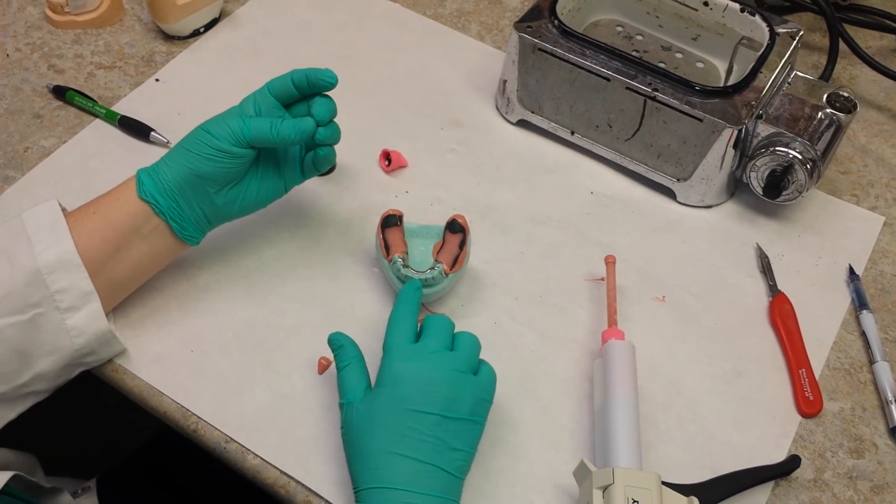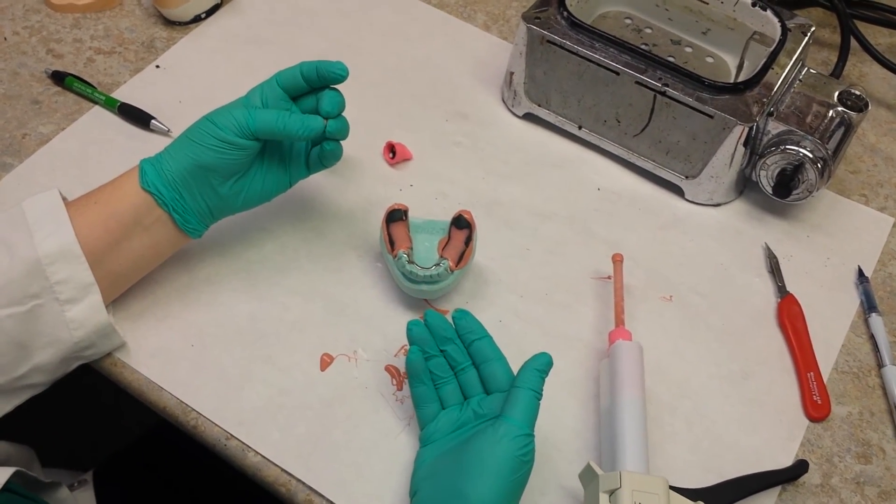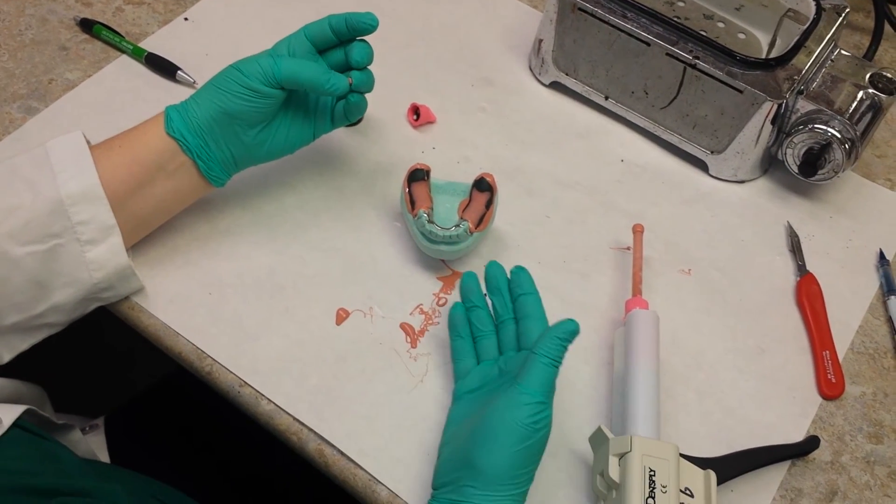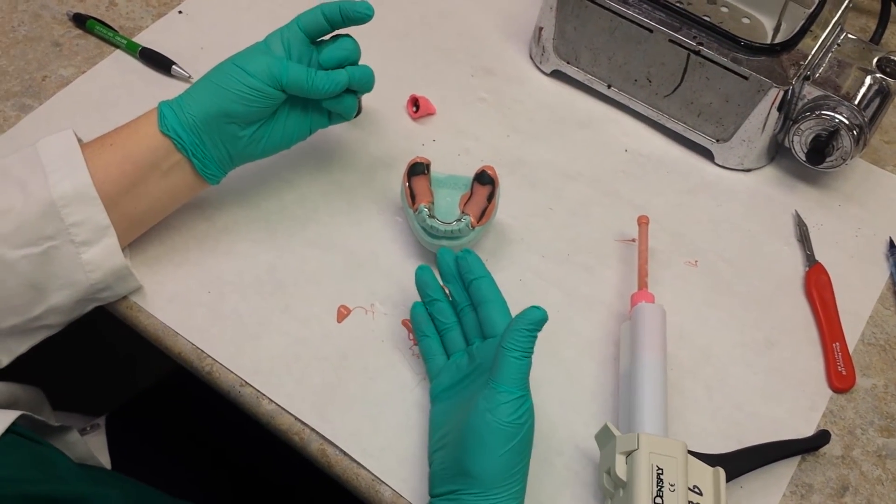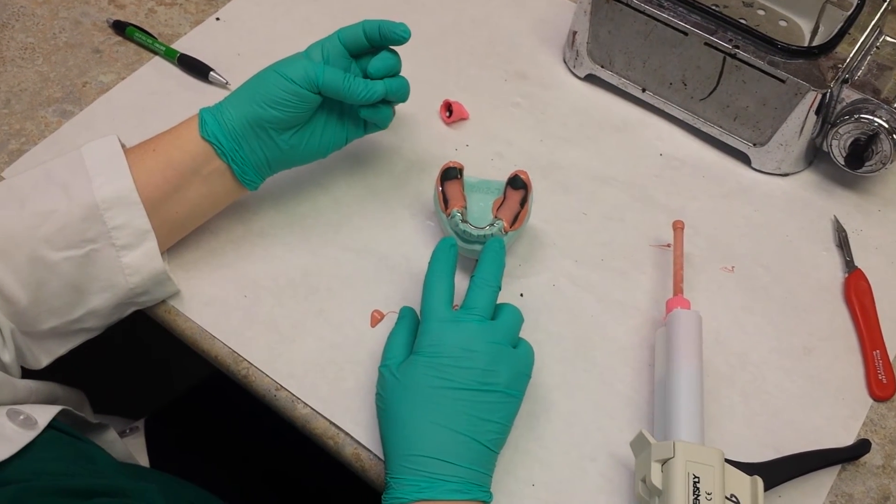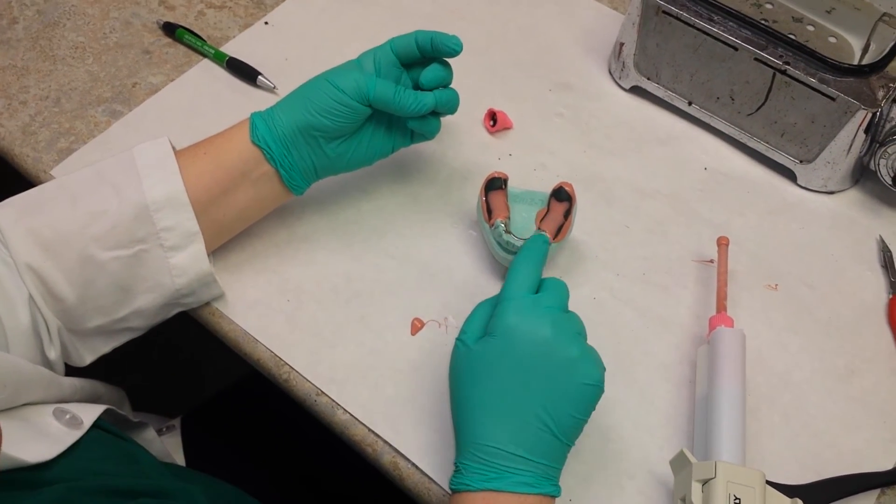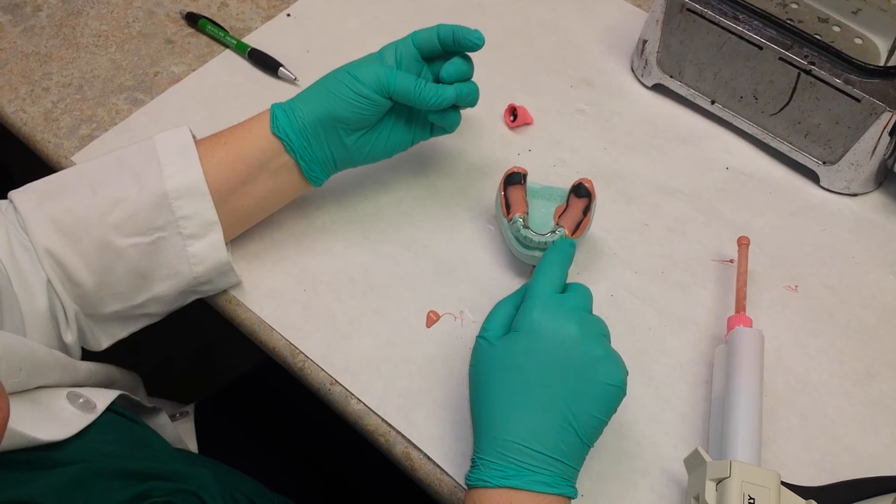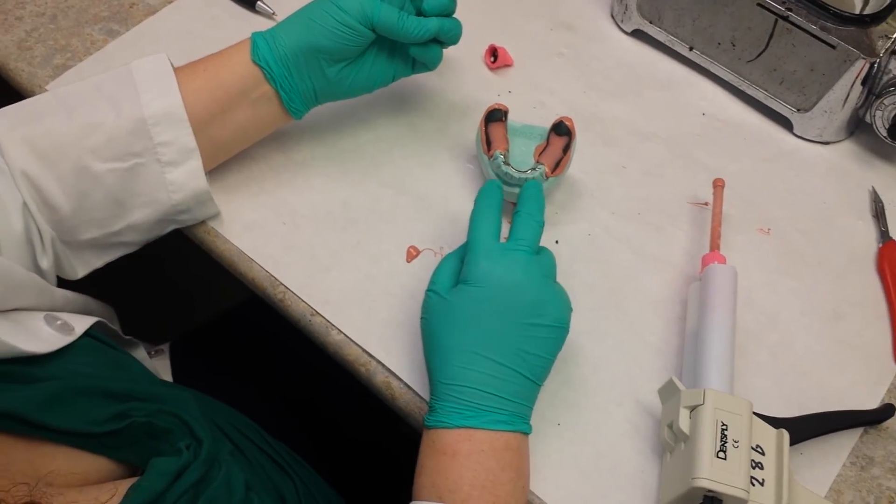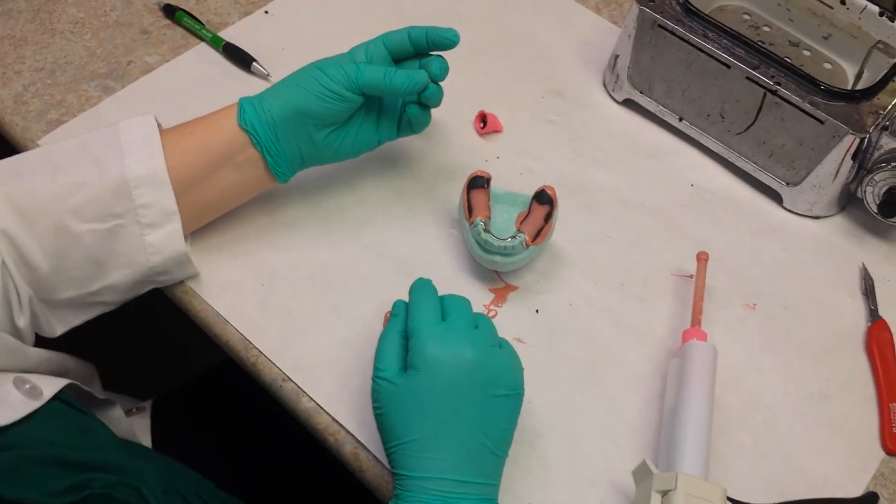Once this is set up all the way, we can take it out of the mouth. In the clinic, you're going to have a faculty verify you can go back in the mouth and that the stops are all seated in the teeth correctly before they send it off to the lab.